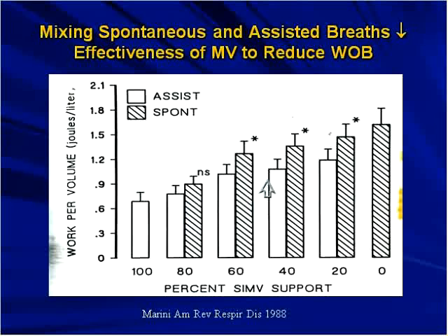That the work of breathing, actually during the mechanical breaths, follows the spontaneous mode. Okay.